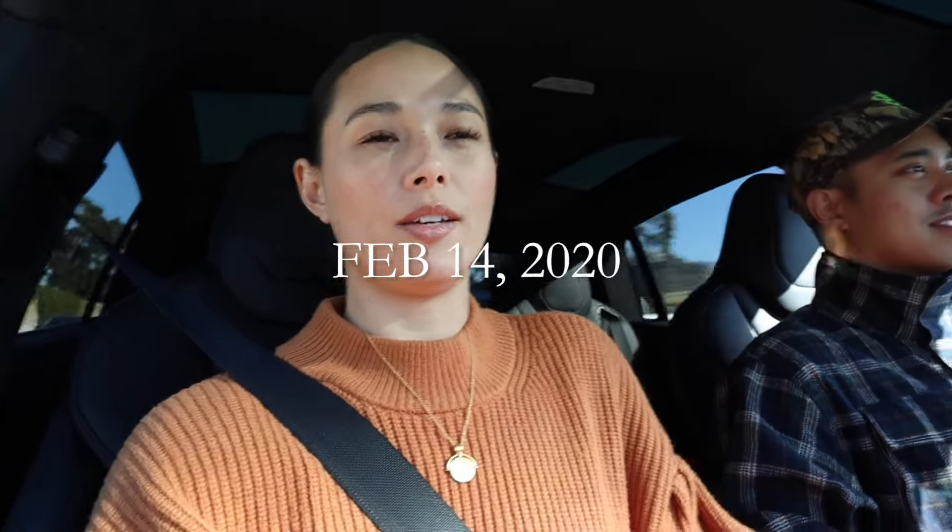It's February 14th, 2020, and we are on our way for our very first Invisalign appointment. For Brian, it's the last kind of thing he has to do on his mouth journey. And for me, it's just something I want to do. My top isn't that bad — I kind of have a snaggle tooth here — but really my bottom is what's crooked, so that's what I'm gonna work on.